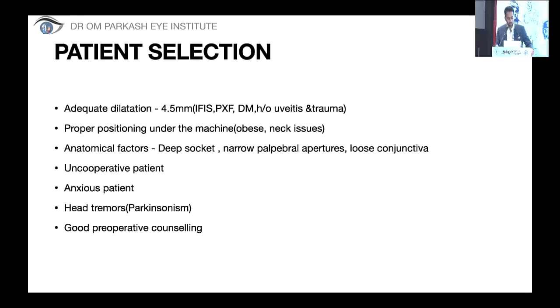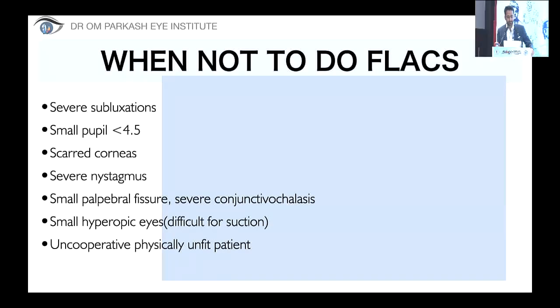Then of course uncooperative patients, anxious patients, Parkinsonism patients with tremors, and that's why I spend some time on good preoperative counseling, so as to check whether the patient is physically fit, has good dilatation, and I explain the procedure to them so that they are prepared for it.